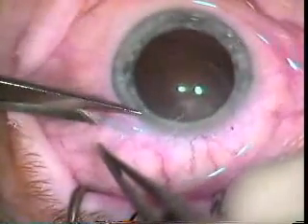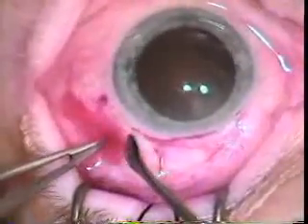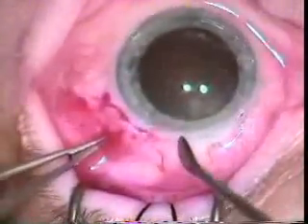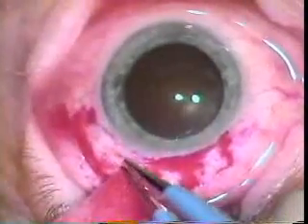These are blunt scissors — sharp Westcott scissors — that he's using to perform the peritomy, which is done with a cord length of about 11 or 12 millimeters. Now he's using the gill knife to clean up some residual episcleral and conjunctival tissue.